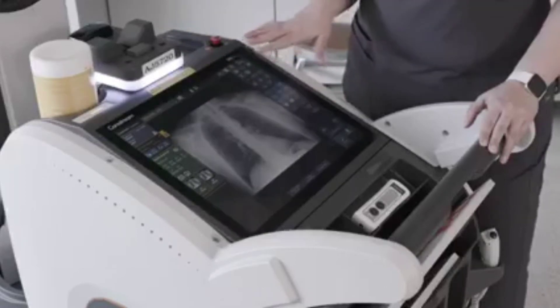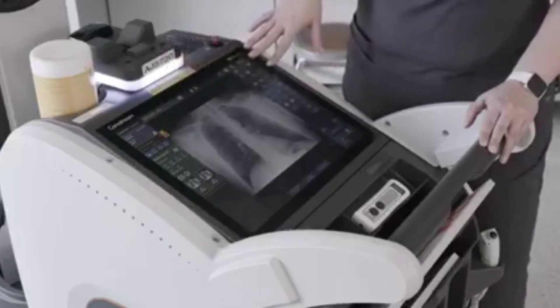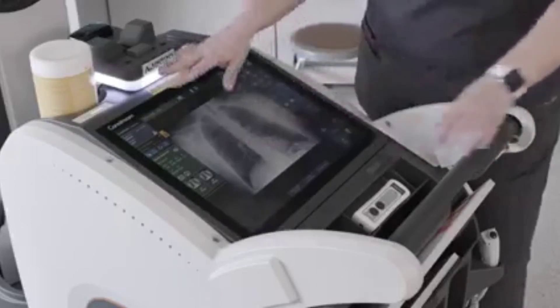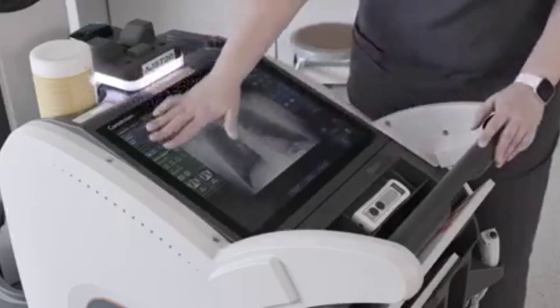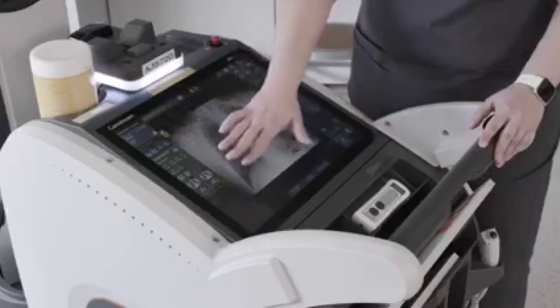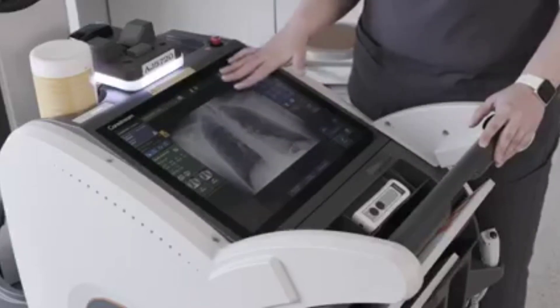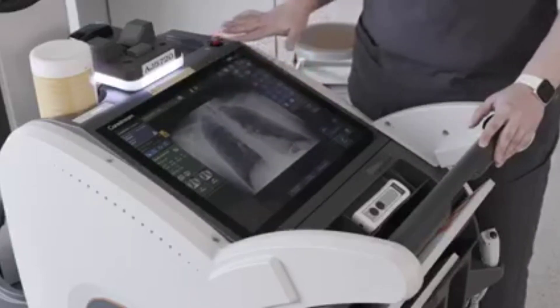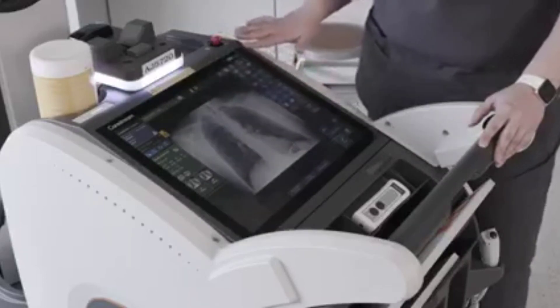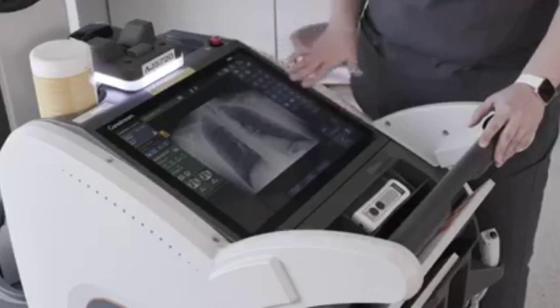One of the main features of the ImageView software is that it eliminates screen transitions and allows the technologist to have everything they need from one screen. From the image acquisition screen, we separated that into panels. The left panel has your patient information and exam information, allowing you to switch between different views within your procedure. In the center stage area, you'll find the image for viewing. And on the right panel, you have access to all your image editing tools as well as your generator controls.